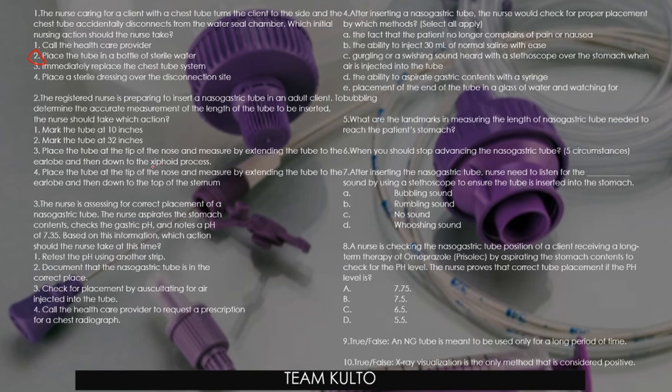The registered nurse is preparing to insert a nasogastric tube in an adult client.